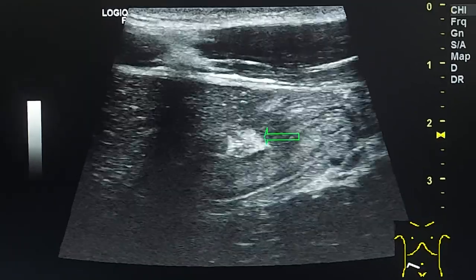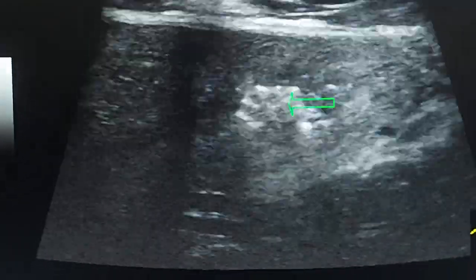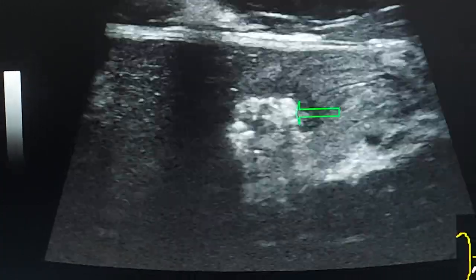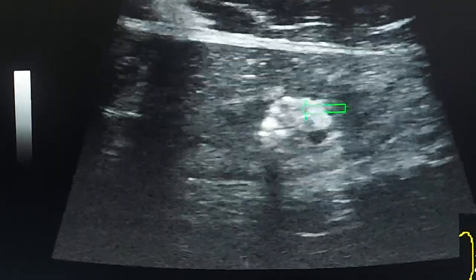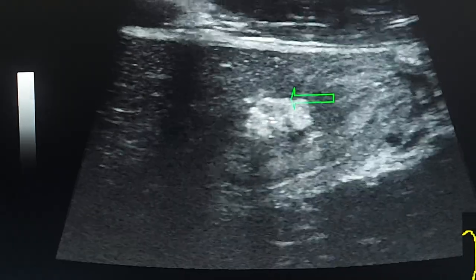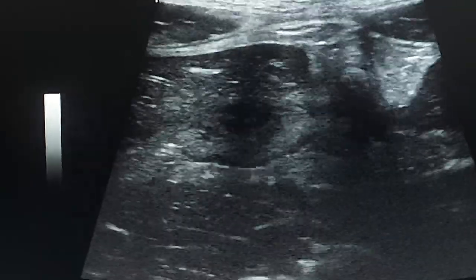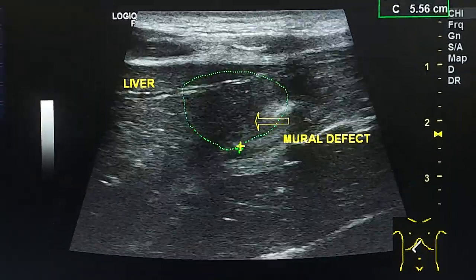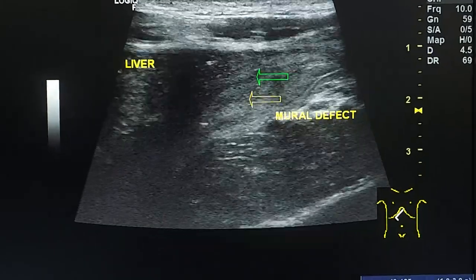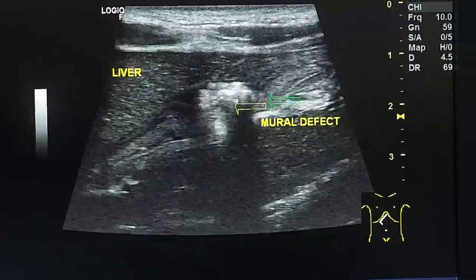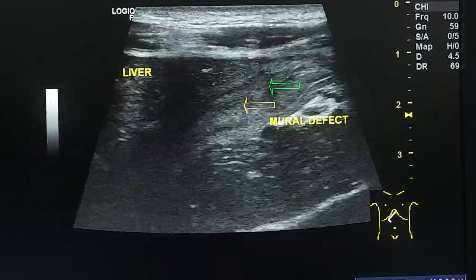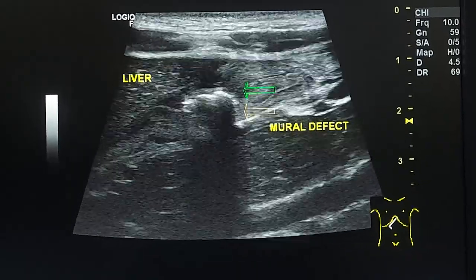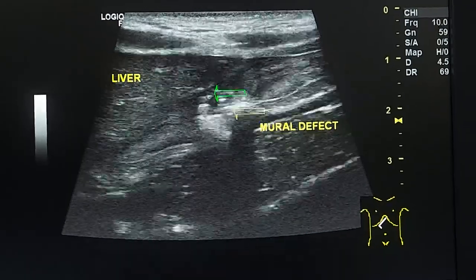This is the defect again, and we see that it contains echogenic foci which are air bubbles from the lumen, and it reaches the serosa. In another view, comparing the anterior and posterior walls of the stomach at the level of the antrum, we don't see all the layers of the wall at the level of this defect — we see only the serosa.